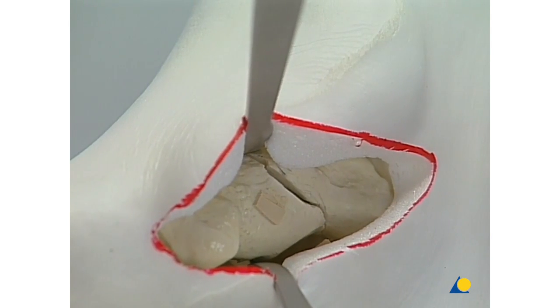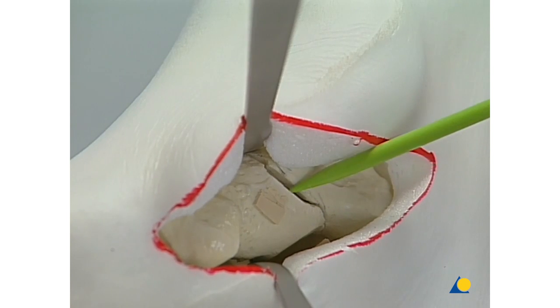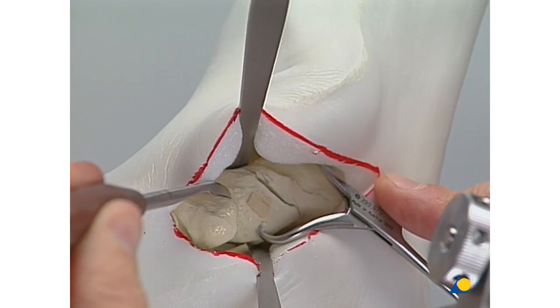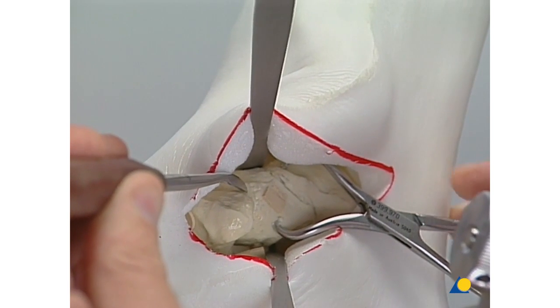The subtalar joint space is distracted and the fracture mobilized. Reduction of the fracture using the small periosteal elevator and a small reduction forceps with points.